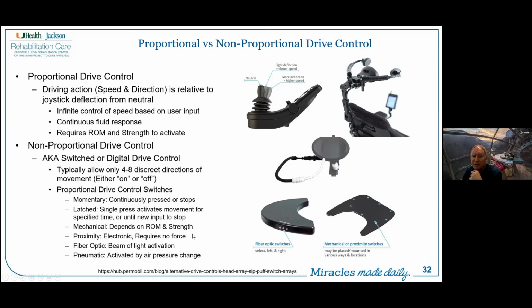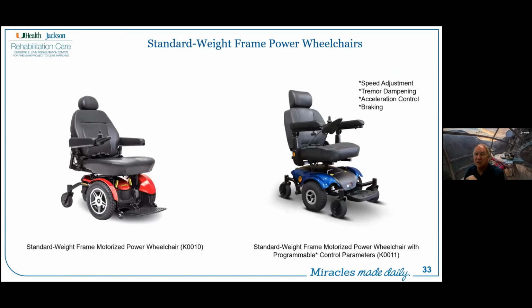So this is the pneumatic type of controller device. And then the electronic requires no force, essentially. So you've got a number of different options, and our therapists are great at knowing, depending upon the person's level of injury and completeness of injury, they will help us to trial different systems. We want to find the system that is going to be the most consistently utilized by the person safely as we go through there.